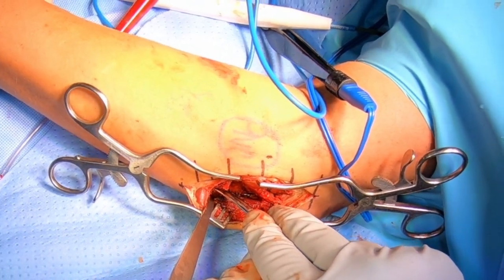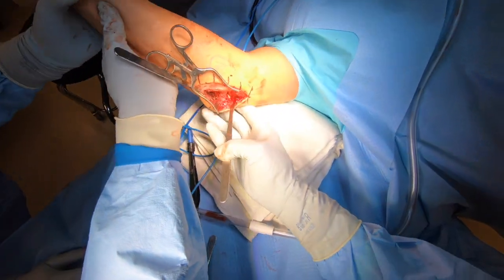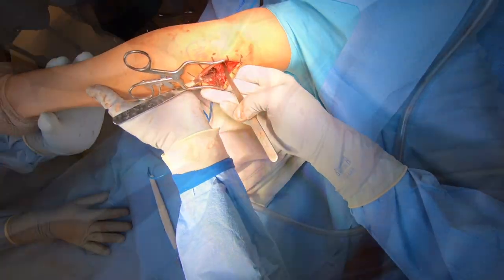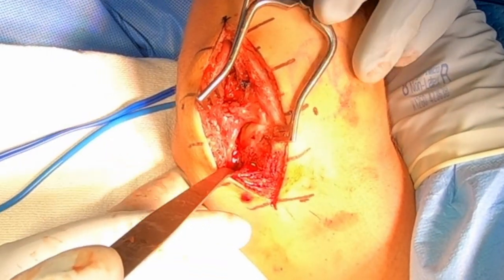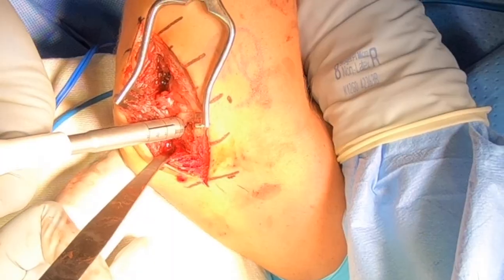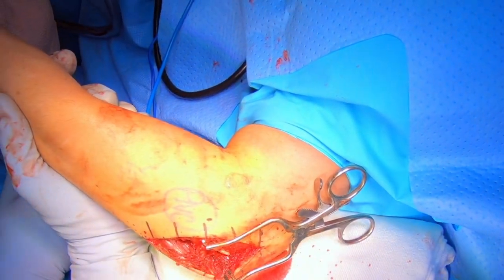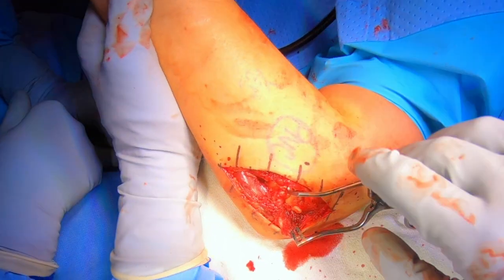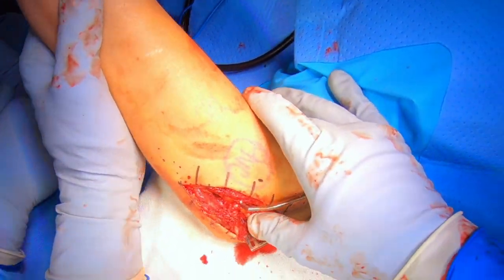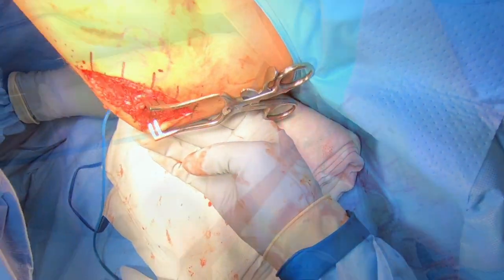We're going to take that tissue from the lower arm bone to the upper arm bone. In this particular patient, there's actually a little defect in the cartilage that you can see right here — that's that red spot. We're going to put in a graft. My partner, Dr. Travis Mack, comes to help me with that. Now the graft is in place. That's not usual, but that's because this patient has had so many dislocations he's damaged the cartilage. With that graft added, we're now ready to do our ligament reconstruction.